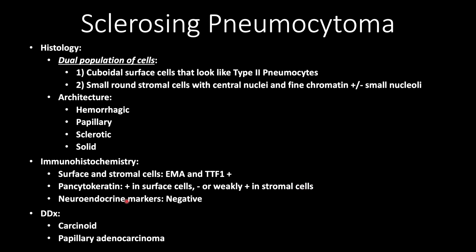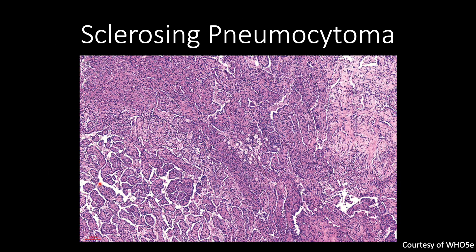The neuroendocrine markers will be negative, and that's important because your differential includes carcinoid, where neuroendocrine markers will be positive, and papillary adenocarcinoma, which you wouldn't have this dual population of cells where only the surface cells stain positive for cytokeratin.